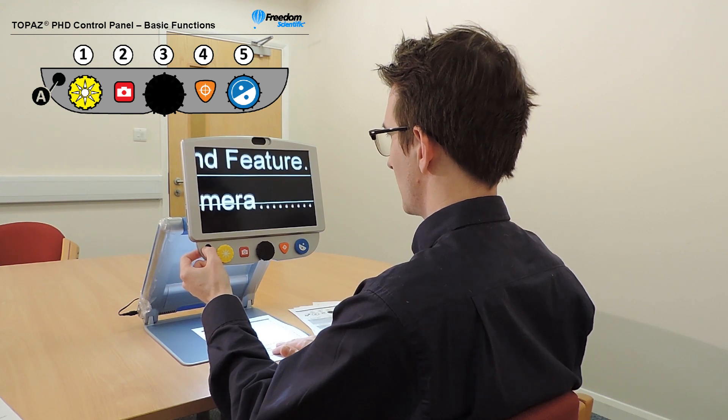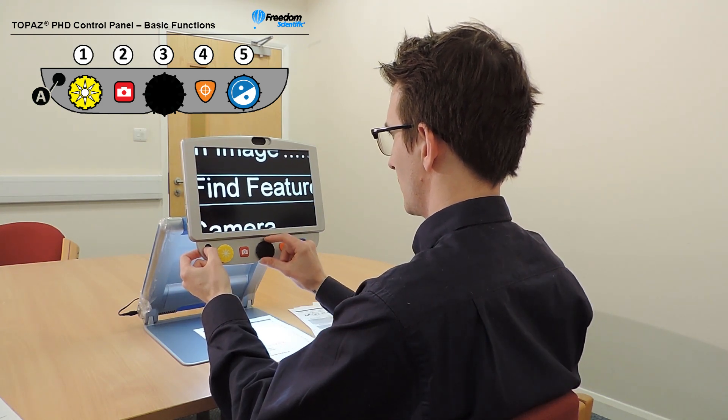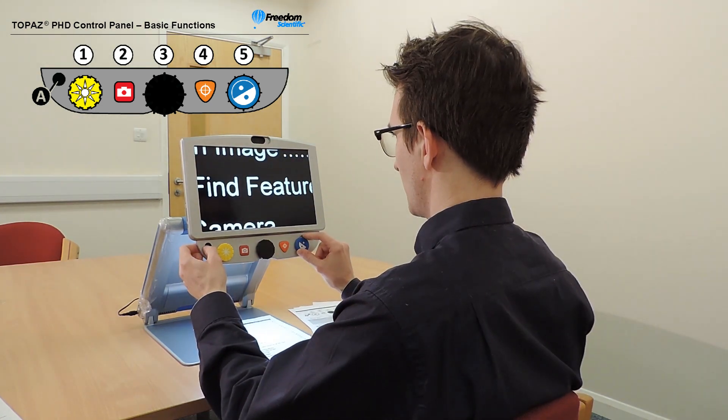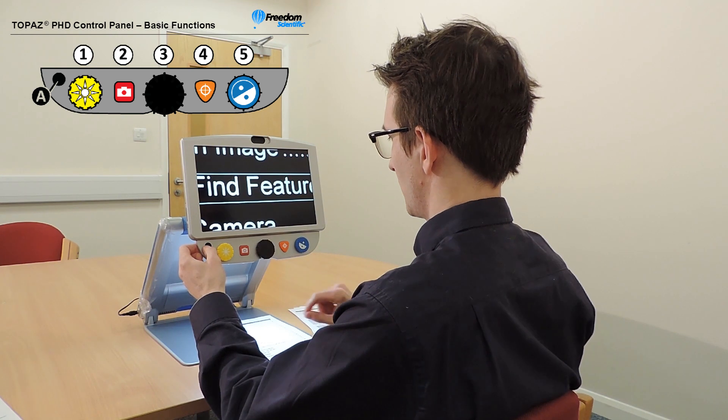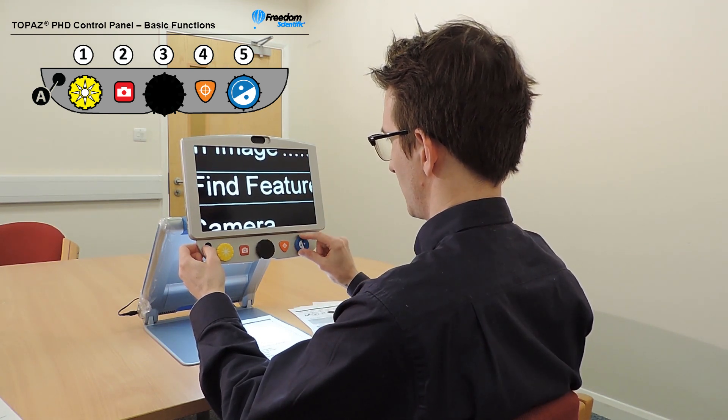Use the advanced button in combination with the magnification dial to cycle through and display horizontal lines, horizontal masks, vertical lines and vertical masks. Then use the advanced button with the blue colour mode dial to adjust the spacing between the lines or the masks.